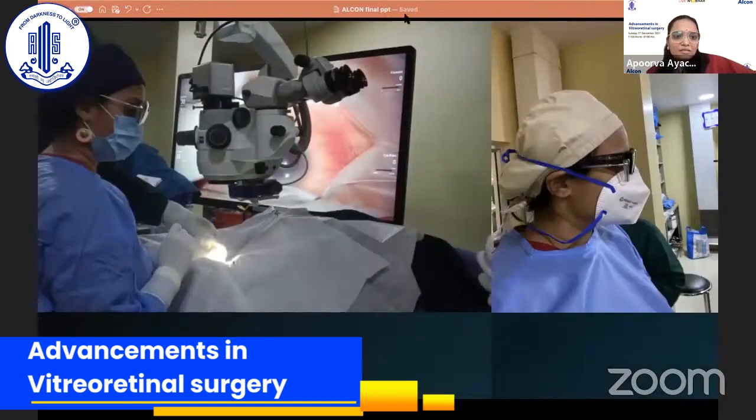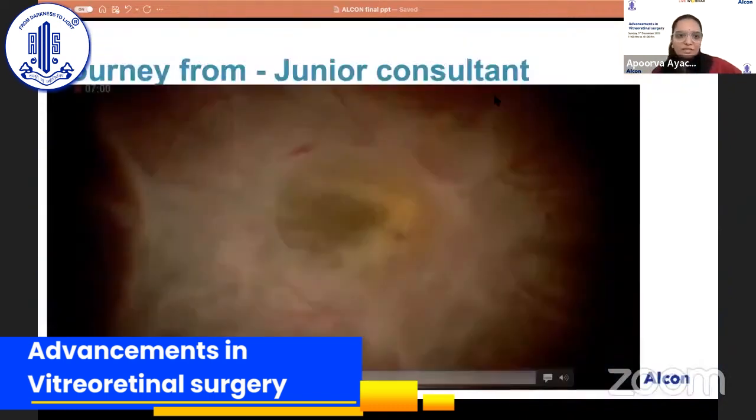the digital system. One more small thing is that for people like us who wear glasses, the clip-on glasses are not good. I don't know if the others agree. It tends to slip down on my nose, so I have circumvented this problem by using the 3D polarized glasses over my glasses. So that's one thing.